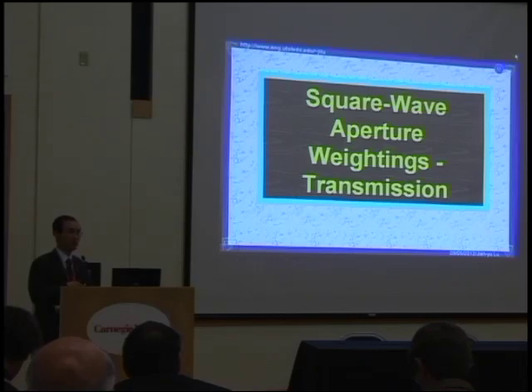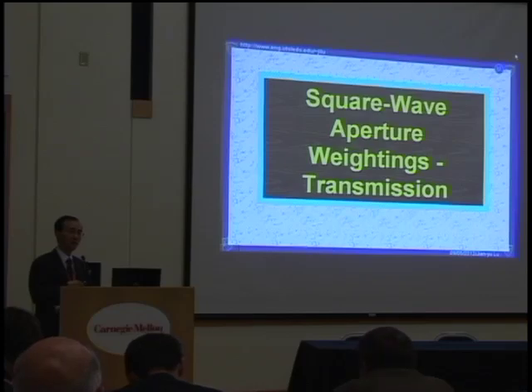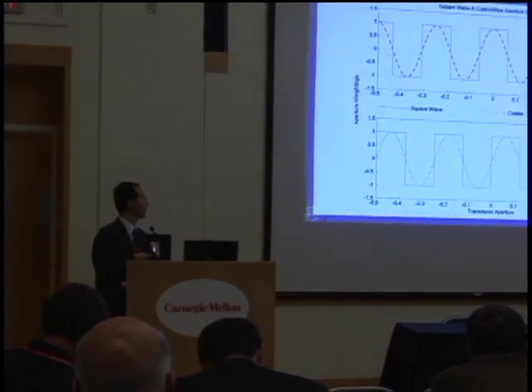So you don't need to have one channel per transmitter. This will save a lot of electronics. In the future, we can entirely fully sample the 2-dimensional array imaging.